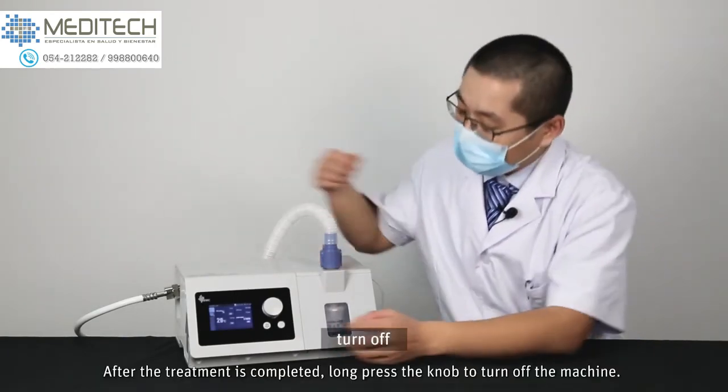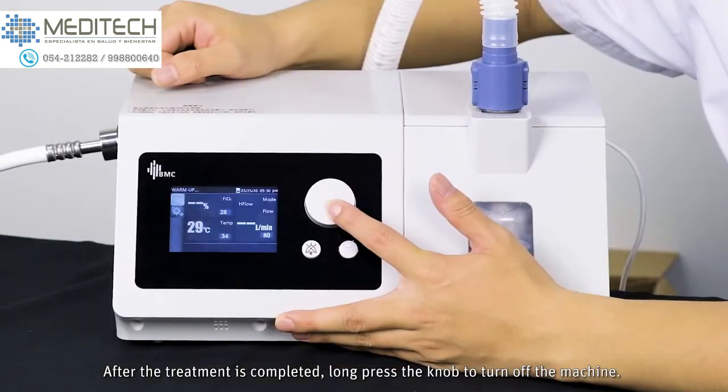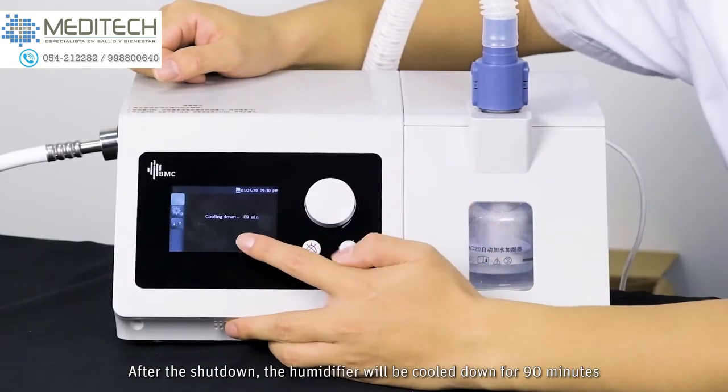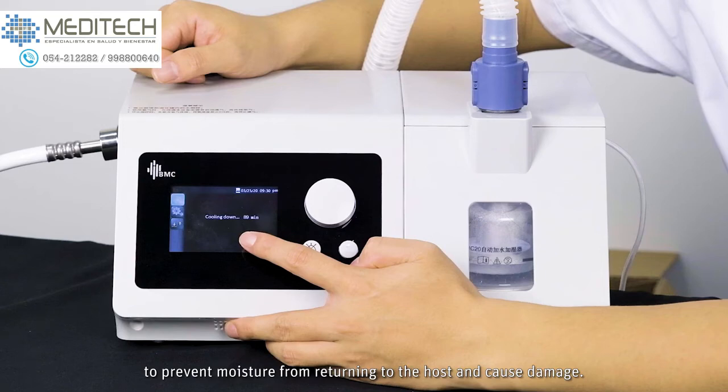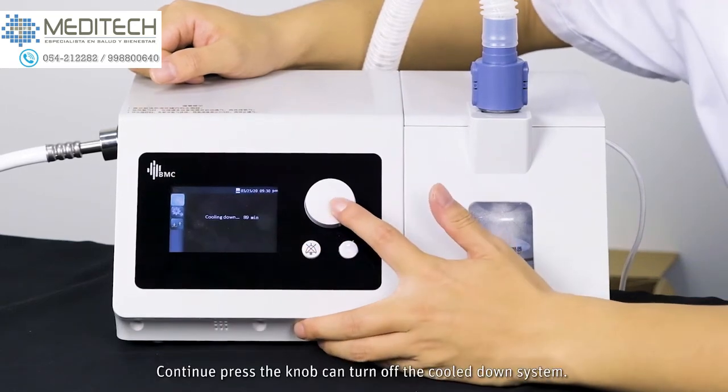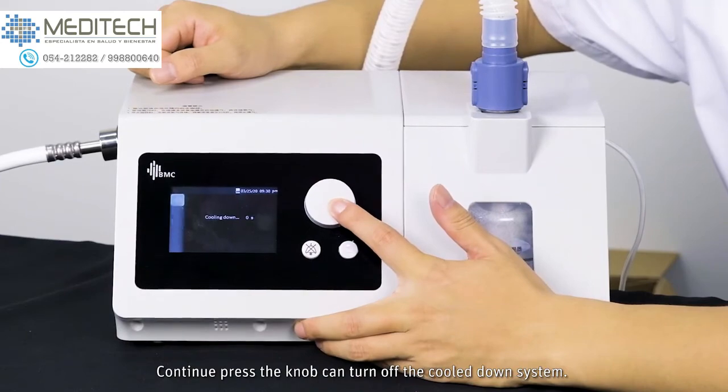After treatment is completed, long press the knob to turn off the machine. After the shutdown, the humidifier will be cooled down for 90 minutes to prevent moisture from returning to the host and cause damage. Continue pressing the knob to turn off the cool down system.